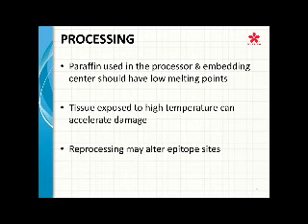In the event that this happens in your laboratory, please be aware that reprocessing can affect immunohistochemistry staining very much so, especially when doing predictive markers and any other antibody, of course. Breast tissue generally gets reprocessed, sometimes often, in a histopathology laboratory. We want to be really careful when we're reprocessing tissue and make sure our pathologists know that this is what we've done, so that they can determine the reactivity of the antigen and the antibody within the immunohistochemistry stain. So going to the next slide.